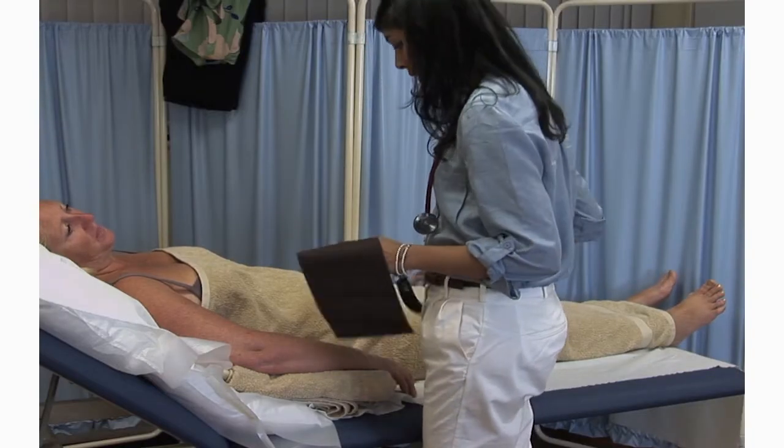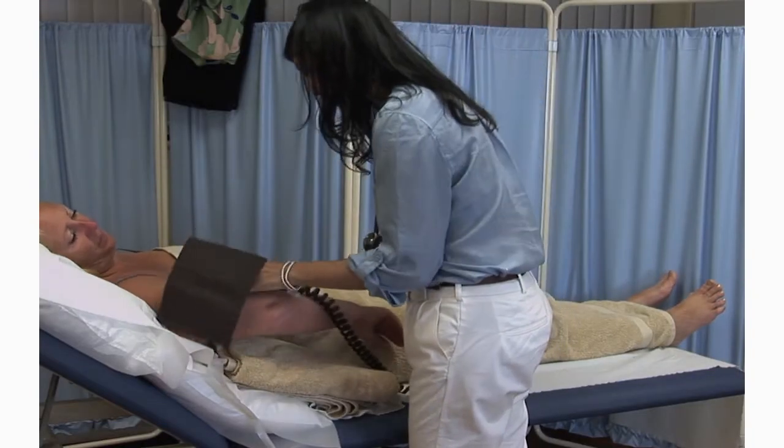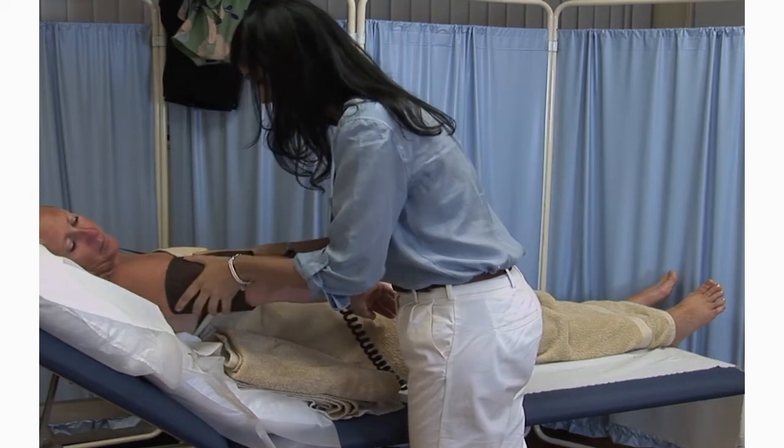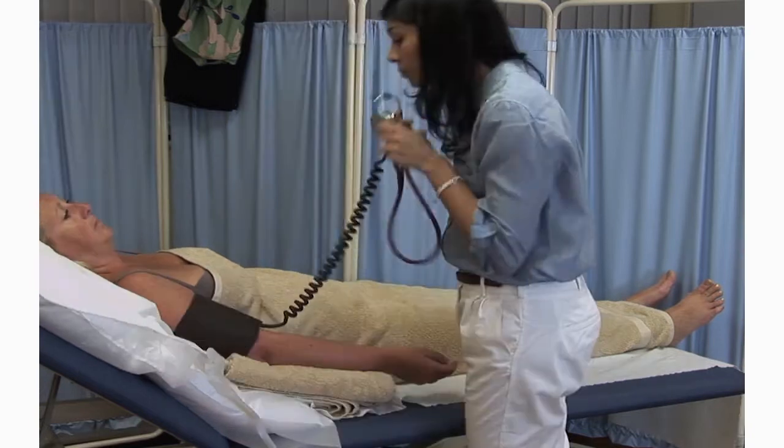Mrs Smith, I'd like to check your blood pressure now. I'm just going to wrap this cuff around your arm and it will get a bit tight. Thank you. And keep your arm rested on the couch.